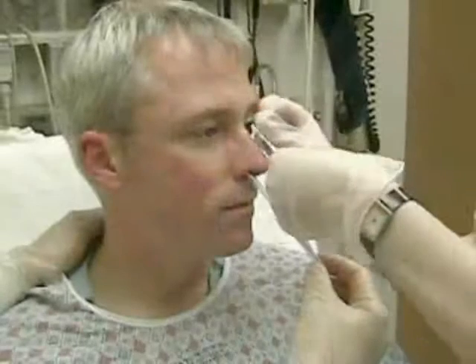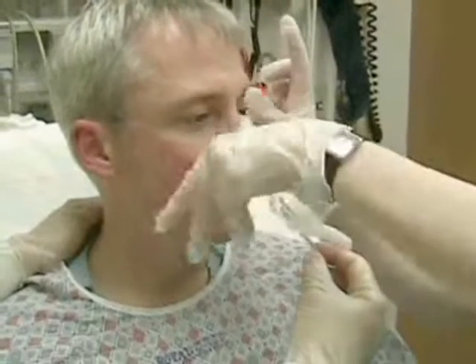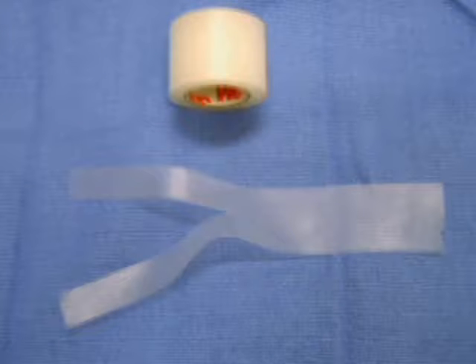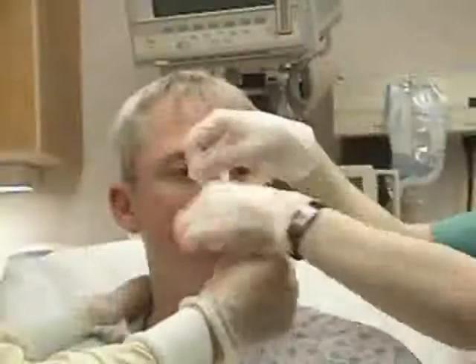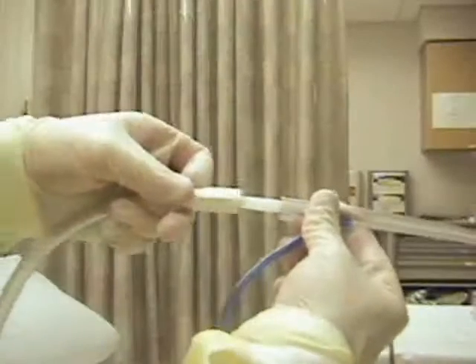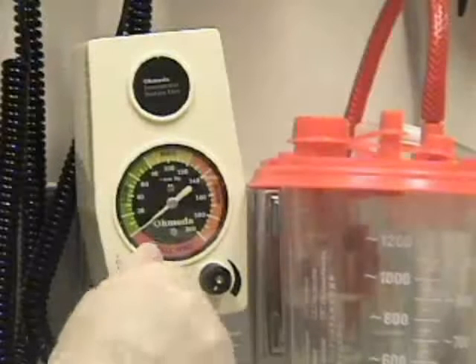The tube should be secured to the patient prior to transport to the radiology suite. Take a 5 to 7 centimeter strip of adhesive tape and tear it vertically for one half of its length. The wide section is placed across the patient's nose, and the two tails are then wrapped in opposite directions around the NG tube. You may now connect the nasogastric tube to suction. Turn on the suction and adjust the vacuum force as desired.